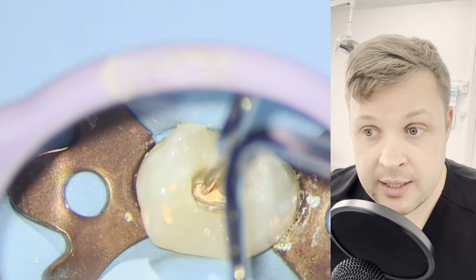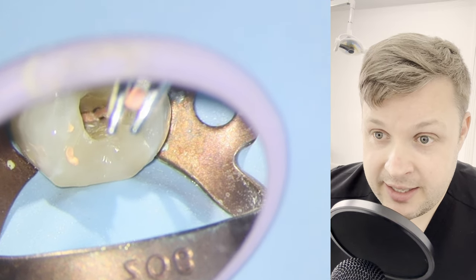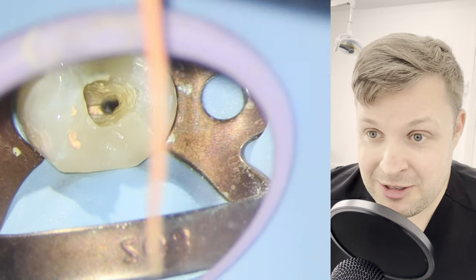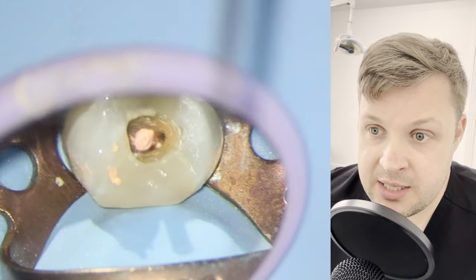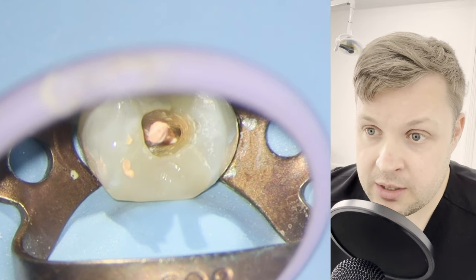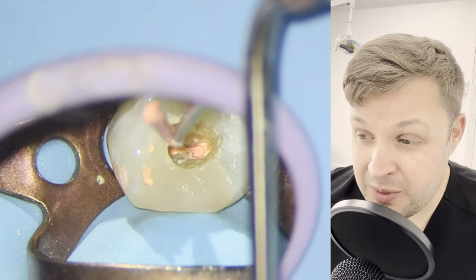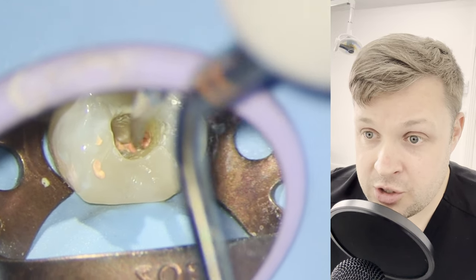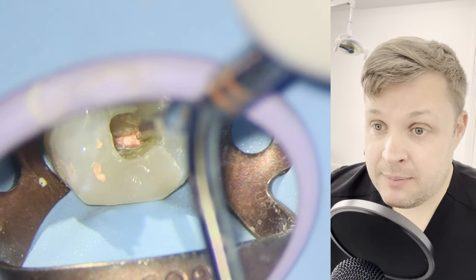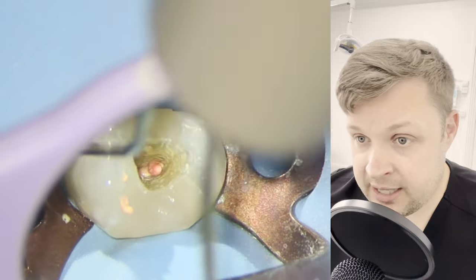What I didn't mention before with the dry run: I'm making sure I'm feeling for tug-back. You'll notice when looking in the microscope there is a tiny little bit of sealer that's squirted through the mid-third of that canal. I'm just putting this GP point to length and doing exactly the same as the other canal — cutting off the excess, compacting down with the heated plugger, pulling it away, and backfilling.